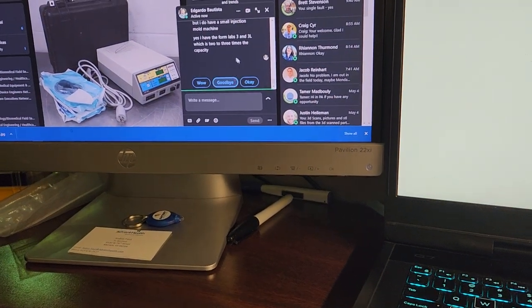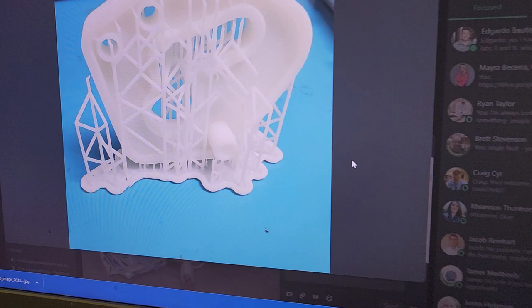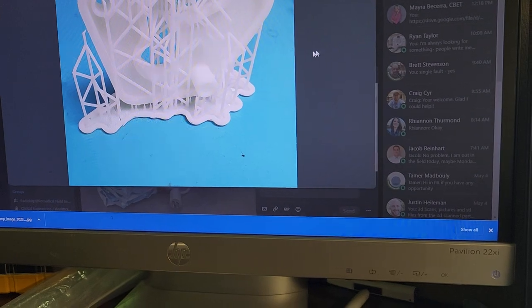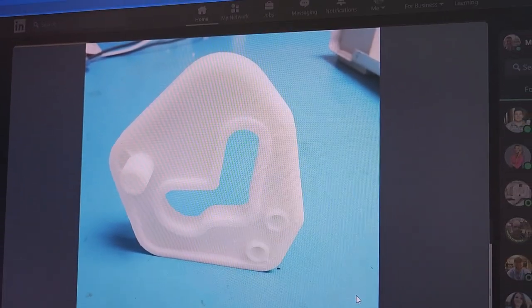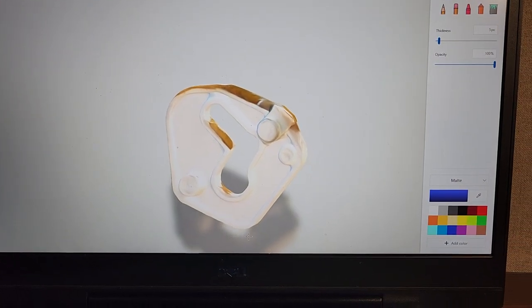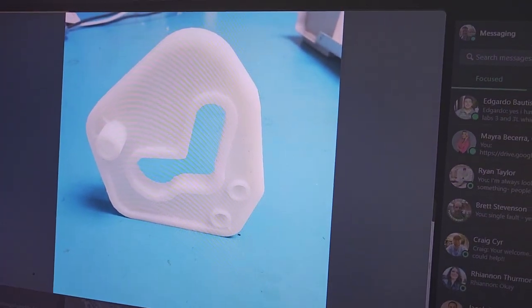Let's roll up here so that y'all can see what some of these look like. So we had a version of it printed, and you can see this is what it looks like when they're on the printer. And the finished part is this guy right here. Is that not beautiful? So, started with a 3D scan of a part, which gives me my dimensions to within half a millimeter accuracy, to a finished part. How's that? So guys, that just goes to show you how social media can help you do business better, faster.